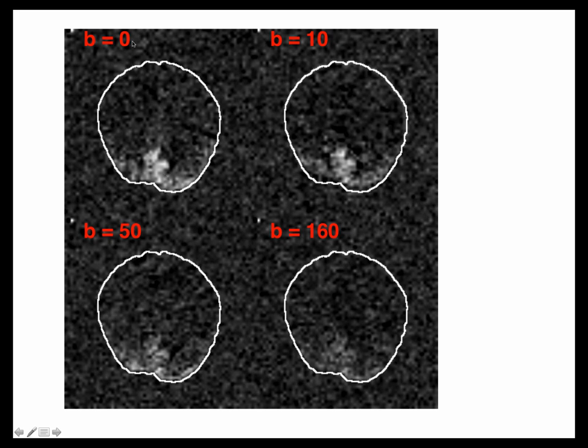And here's the maps. B equals 0. This is a measure of diffusion weighting. B all the way up to 160. You have almost no contrast left.